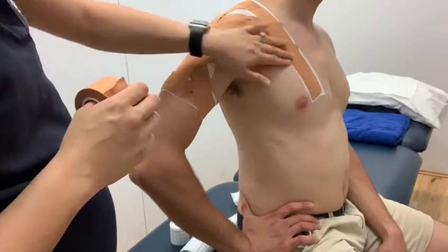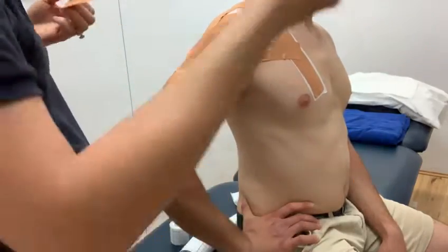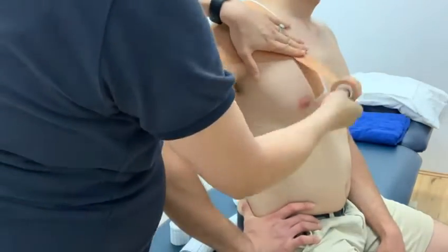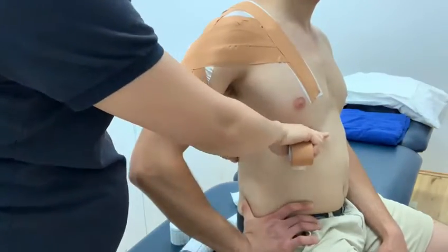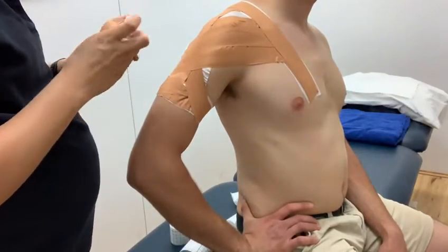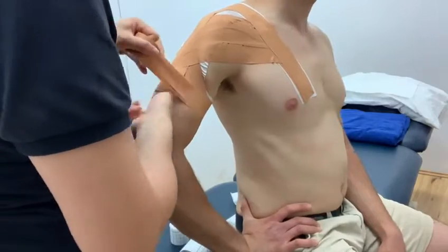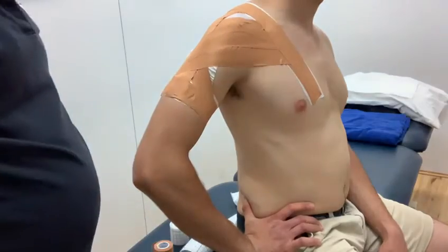You will change the tape direction for different pathologies. But if you're just doing a general one, it's the first technique I did, and you always anchor off. If this patient is going onto a sporting field, the anchors come down around the chest and you would overlay all the way around the chest, because shoulder taping is notorious for ripping off during a game if you do not anchor it properly. It looks really extensive, but it keeps it on. So this is your general basic rigid shoulder taping.